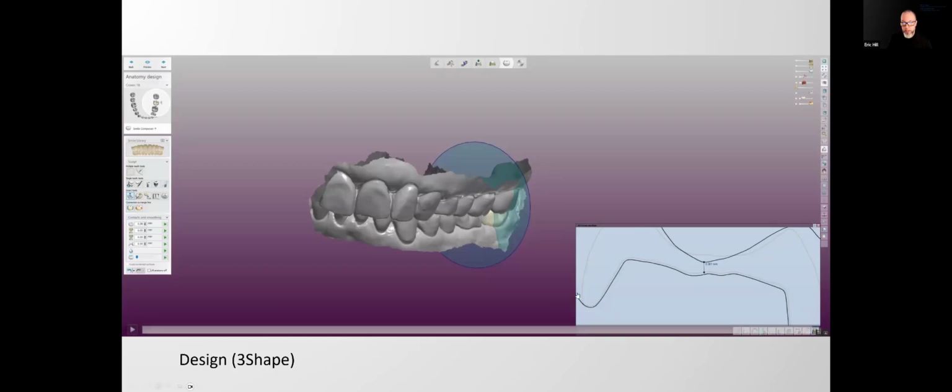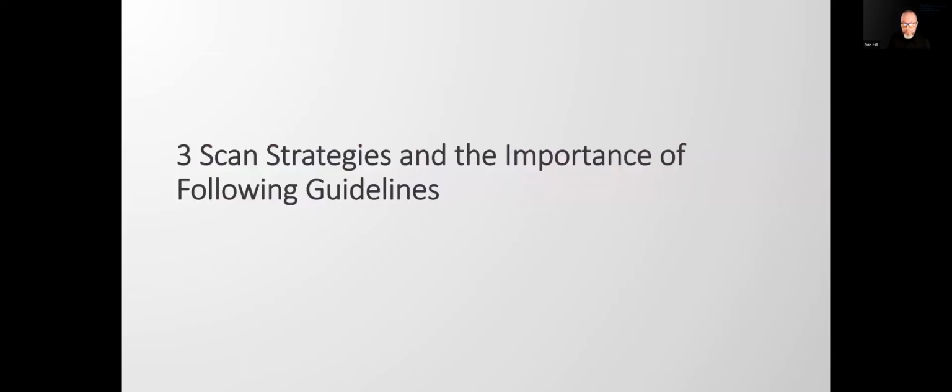So certainly look into that, and that's usually the reason why you're getting cases back with no anatomy or something that's not very pretty. One of two reasons you're going to get that: they have no room to make any sort of anatomy in there. Secondly, they're trying to replicate what the adjacent teeth look like to make it look a little more natural. So consider that as well.